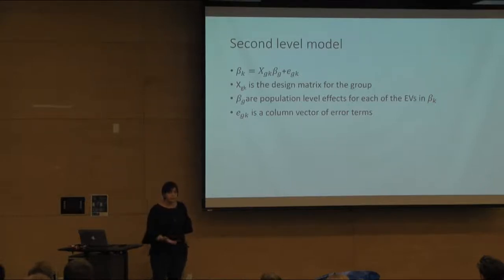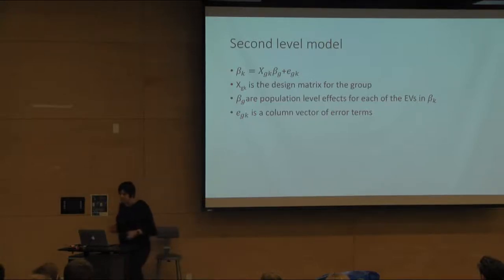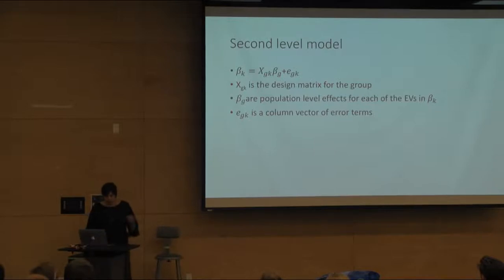So statistics have been derived to do that, and different methods for dealing with that estimation. But essentially what you're doing is just a mixed effects model. You're just doing it in 2 levels. I won't go into details on that, but there's a tutorial that this is based on that does explain that in more detail. The reason you don't put this into R typically from the start has been computational. It's been because the limitations on memory and compute for a single machine have been small, and they're not anymore. So I'm making an argument that we should perhaps reinvestigate some of the assumptions that have led to this. Not that everything is bad, but that we might be able to do a little bit more.